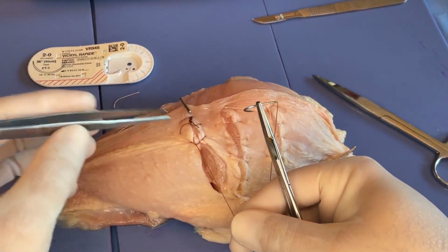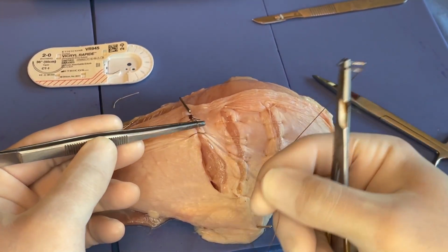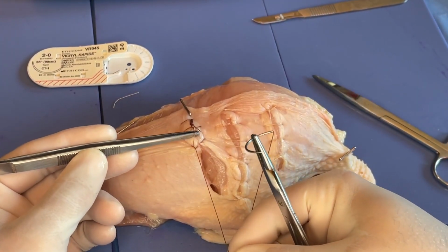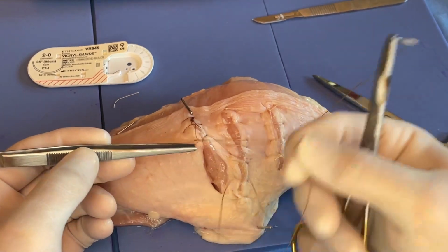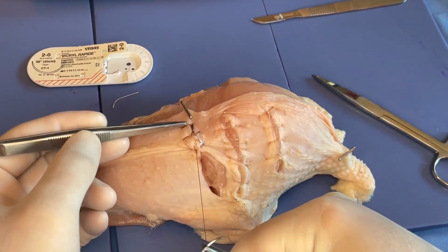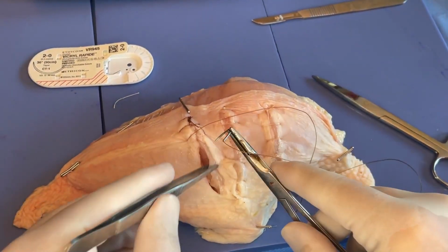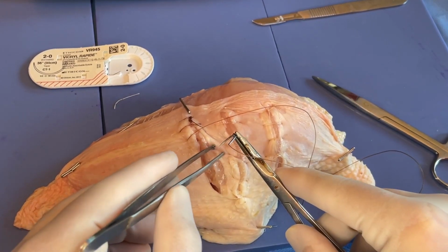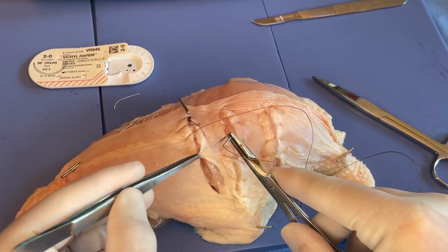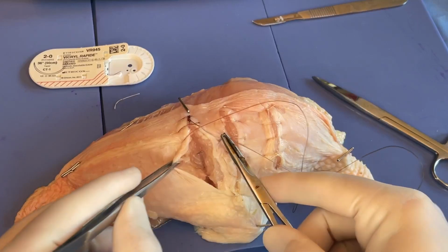So as we do that, you can see that we have suture here. We're not only doing the loop through the tissue, but we're creating this little extra strand that comes down. So we're getting more compression of the tissue, and we'll just continue to do that. We can see there's a little bit of skin pulling away from the edge, so I can specifically grab that skin edge and pull it over to make sure that I get it in my closure.